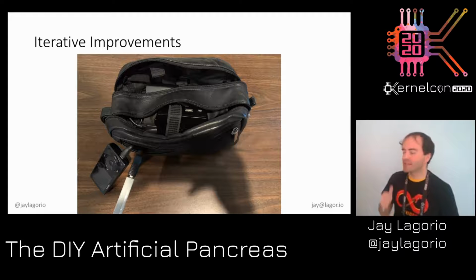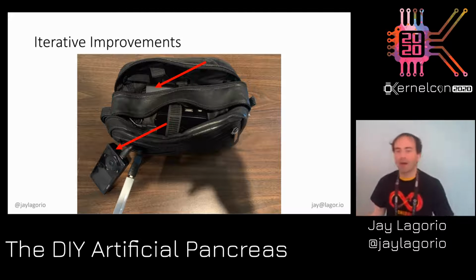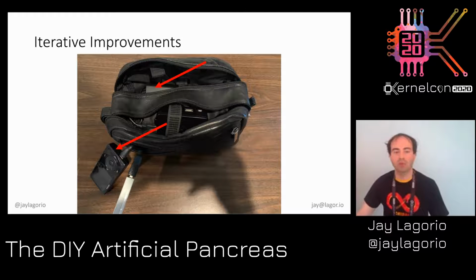This is a more broken out view of the shave bag that I just held up. That's a 26 amp hour USB battery. You get about 24 to 36 continuous hours of operation from that. That's the original G5 receiver. This one is the newer G6 one. It's a touch screen, so it's confused for a phone by all the wrong people.